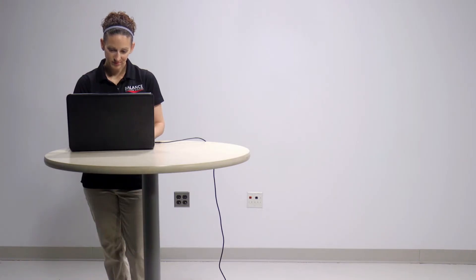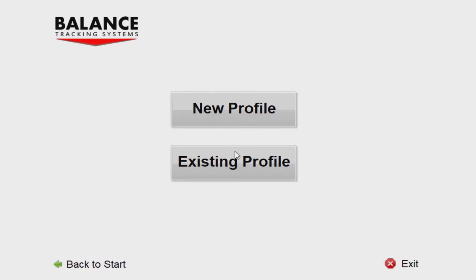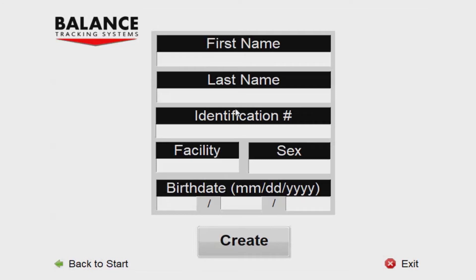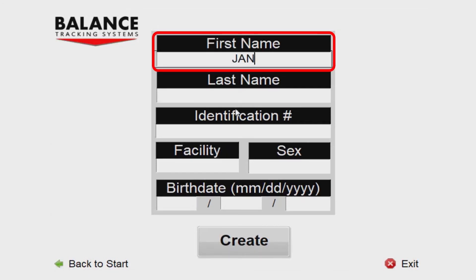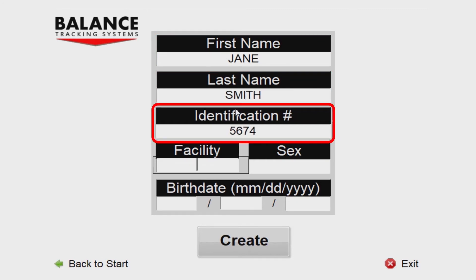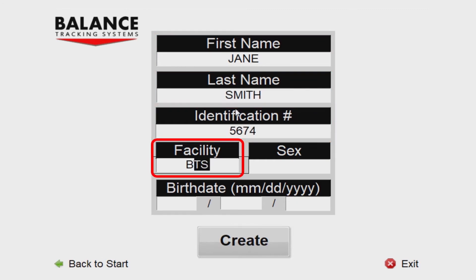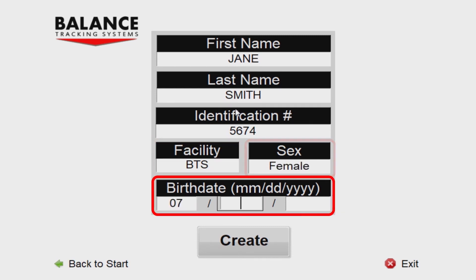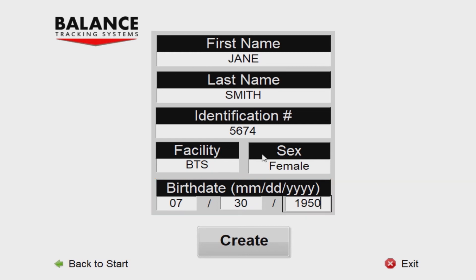Next, you must create or select an existing profile for testing. To create a profile, press New Profile. You will be taken to a screen where you can enter the First Name, Last Name, Identification Number, Facility, Sex, and Birthday associated with the person being tested. Once all fields are completed, press Create.